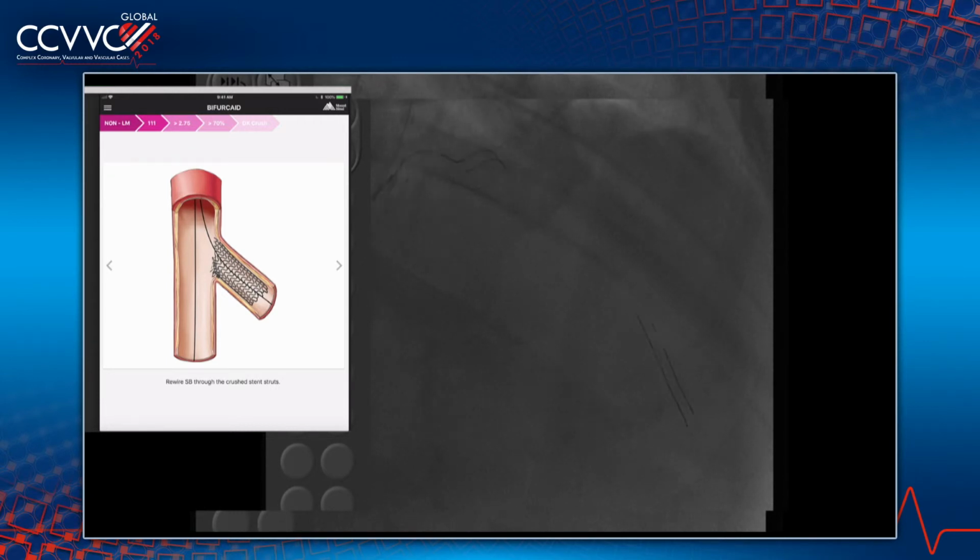But she will get it. You only have to take your time, it's fine. Did we crush enough, right? It was a small balloon in the LAD. No, we did a 3.0. Was 3.0? Yeah, 3.0 should be it. You might use a larger stent anyway in the LAD. That was a 2.75. There you go. Beautiful. It's a top branch. Yeah. Nice.